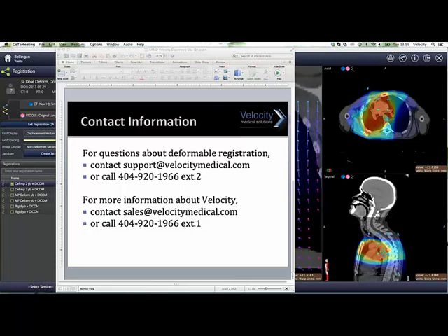Now we're at the point where a lot of sites are acquiring this technology, and that's why it is such a hot topic at AAPM and AAMD, because they're concerned about the accuracy of the deformable, and can you deform dose? They do have a task group with AAPM, task group 132, and they should be coming out soon with some recommendations of how to QA whatever deformable product you might have or buy.